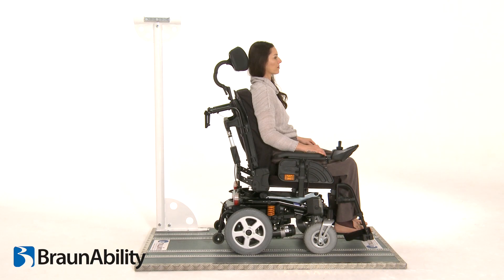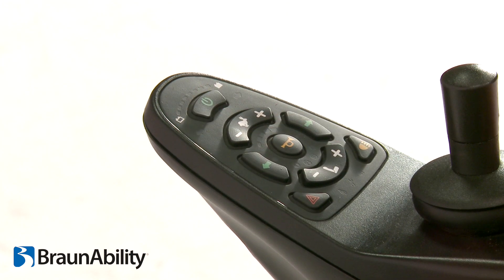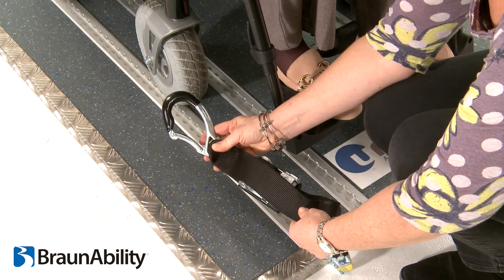Position the wheelchair centrally over the floor rail and turn power off. Place Titan 1 front straps with the carabiner facing outwards.